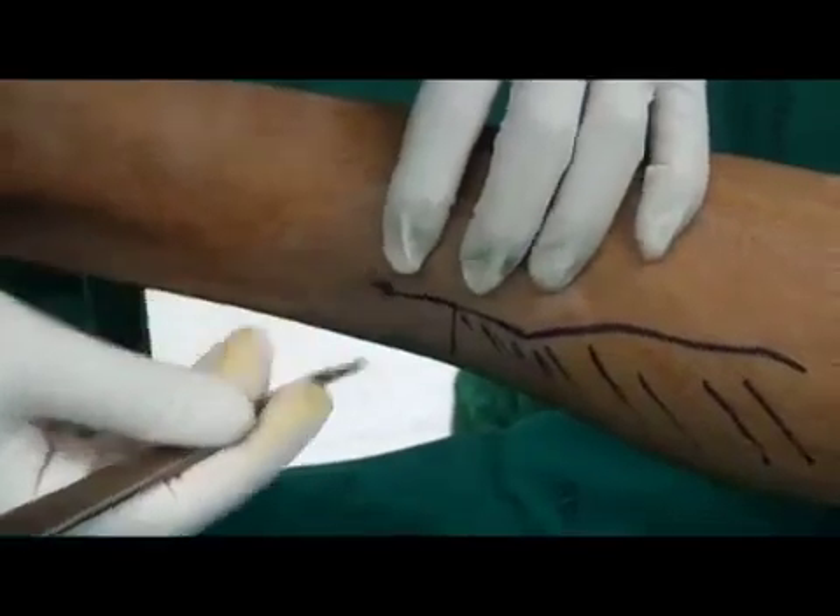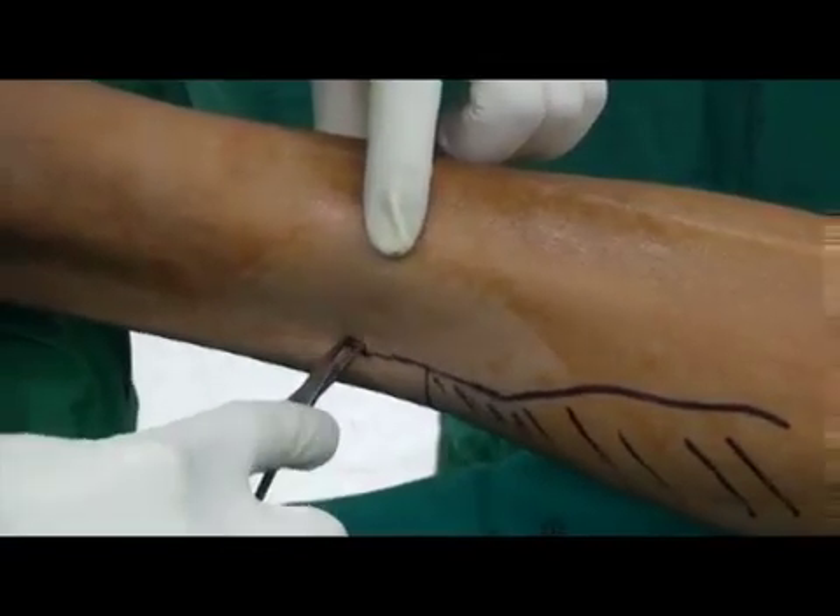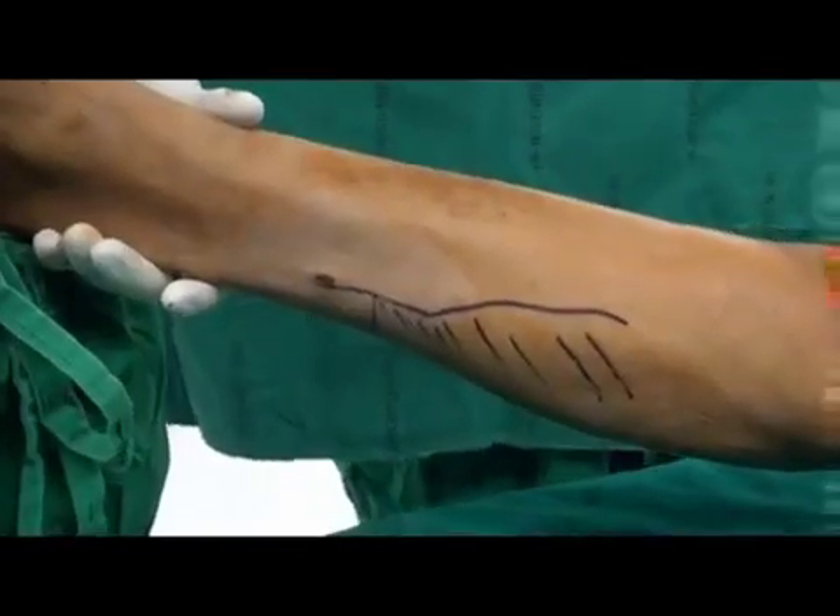A number 15 scalpel is used to open the medial portal. The skin and soft tissue are dilated using a hemostat.